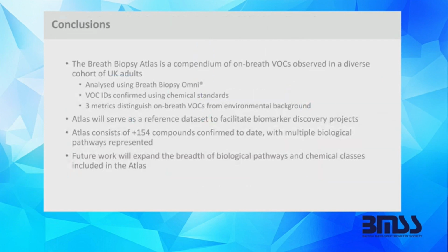So, to conclude, the Breath Biopsy Atlas is a compendium of on-breath VOCs observed in a diverse cohort of UK adults. The Atlas will serve as a reference dataset to facilitate biomarker discovery projects and currently consists of 154 compounds with multiple biological pathways being represented. Future work will expand the breadth of the biological pathways and chemical classes included in the Atlas.